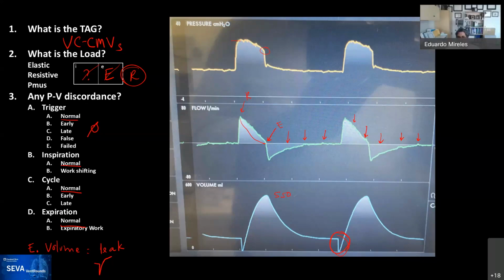I think that what you're talking about is the variability of the resistance. So the altering resistance can either cause hypoventilation or very large tidal volumes in patients as they resolve, and your manifestation of somebody with worsening bronchospasm, if you're on volume control, would be an increasing peak pressure, right?